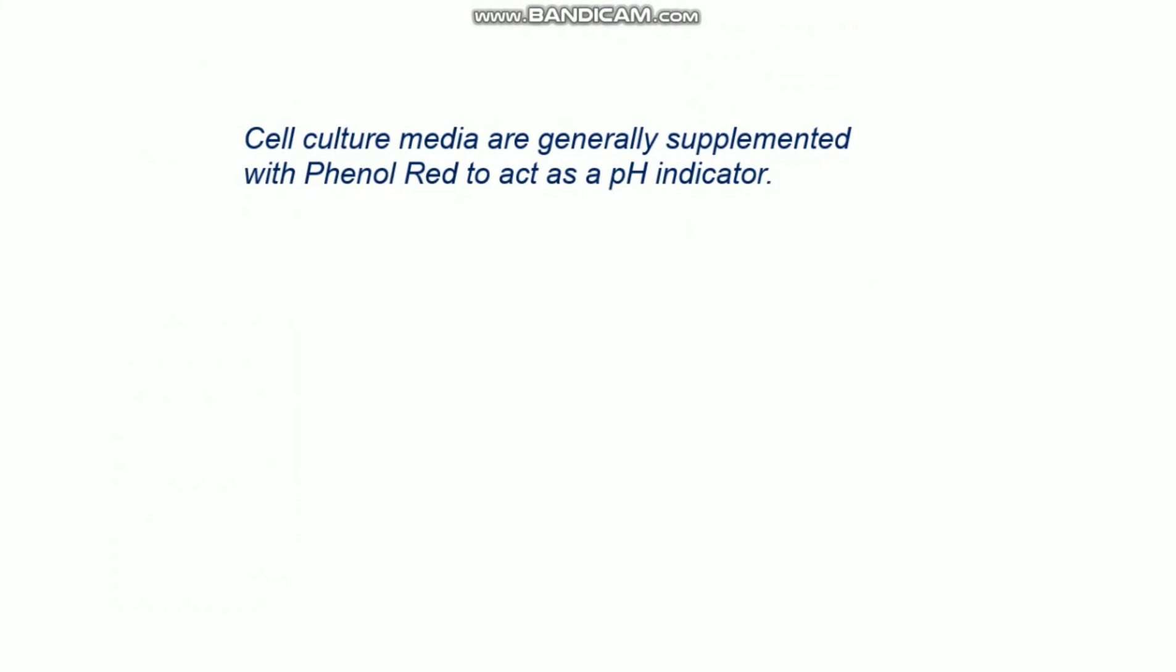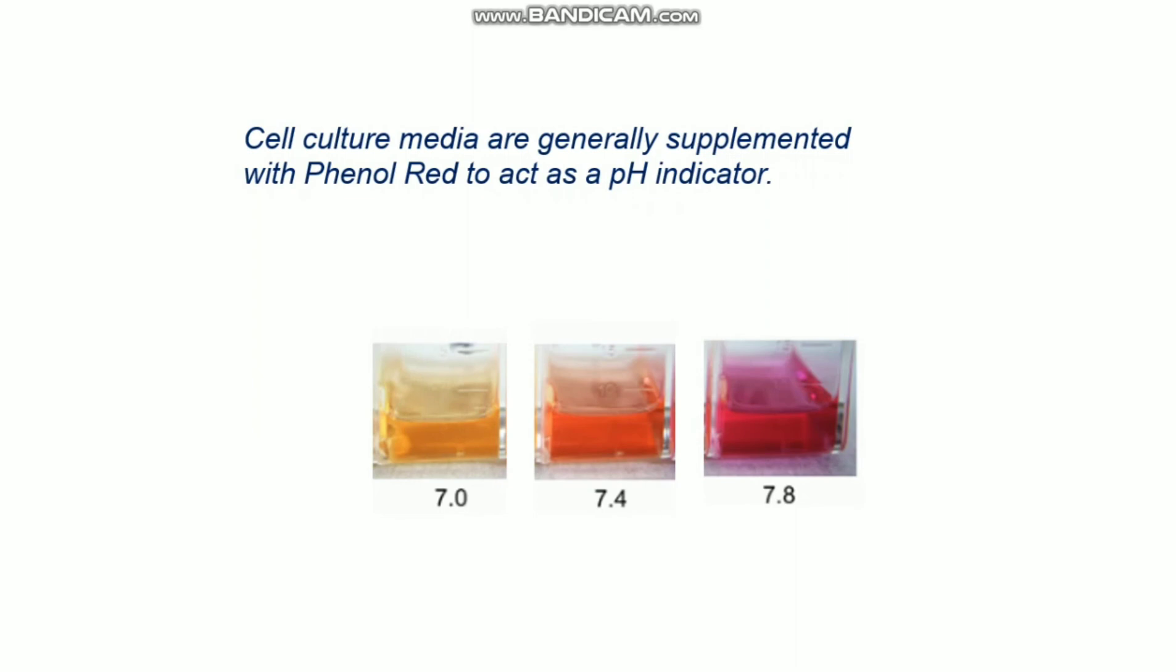Cell culture media are generally supplemented with Phenol Red to act as a pH indicator. The cell culture medium has different colors. This color is because of this Phenol Red that acts as a pH indicator. If your media color is like this, then it indicates 7.4. If it changes a little acidic, then it turns to little yellow. If it is a little alkaline, then it turns to little pink color. If it is more acidic, then it turns to more yellow, around 6.5 pH. This is how you can visually check the rough pH by the color changing of the cell culture media.